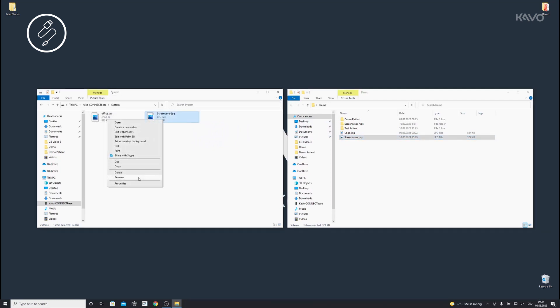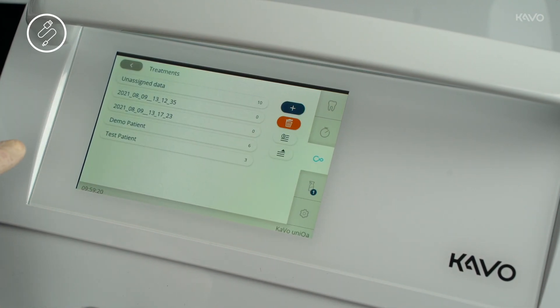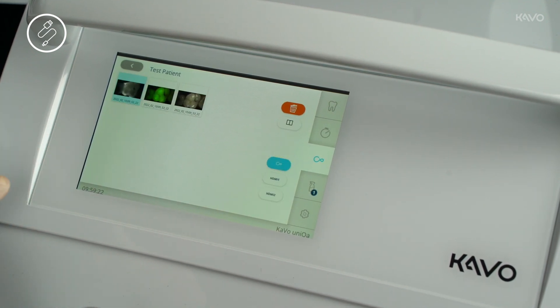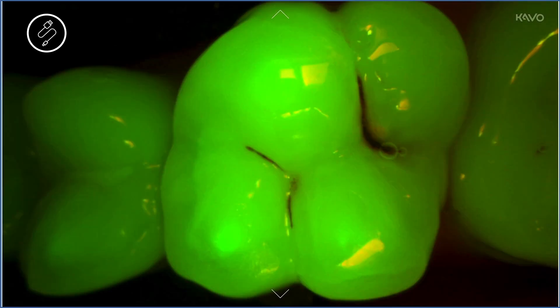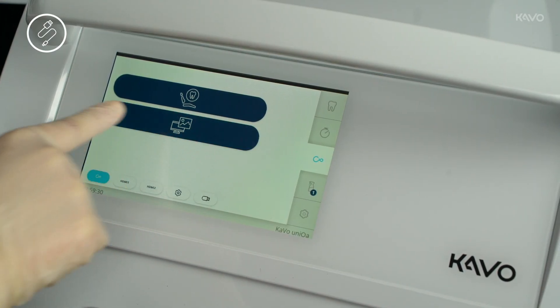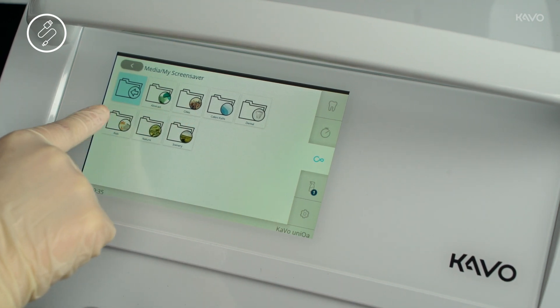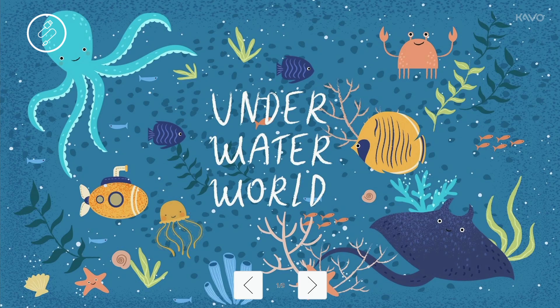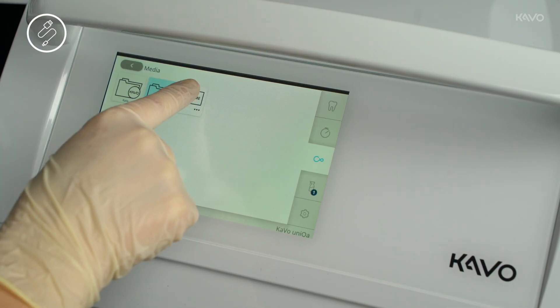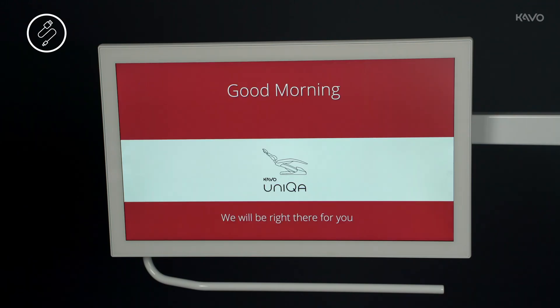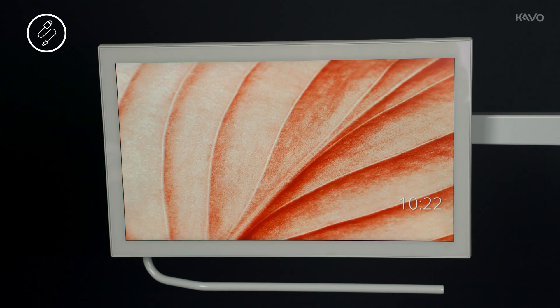The copied data is automatically available on your treatment unit as soon as it is stored in the Carvo ConnectBase drive. Treatment data are automatically available in the folder structure and media are automatically available in the Media menu. If you have imported an Office logo, it is automatically stored in the Welcome screen. If you have imported a screensaver, it is automatically active when the Carvo ConnectBase menu is exited.